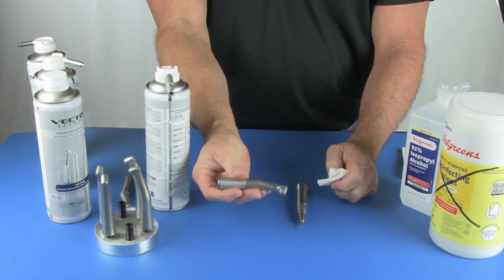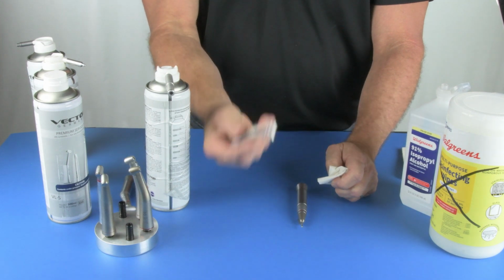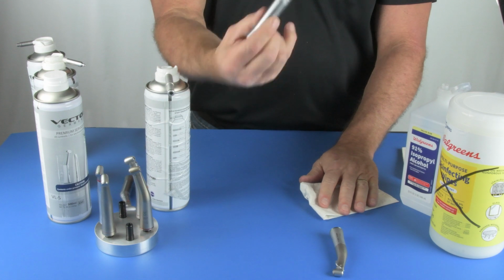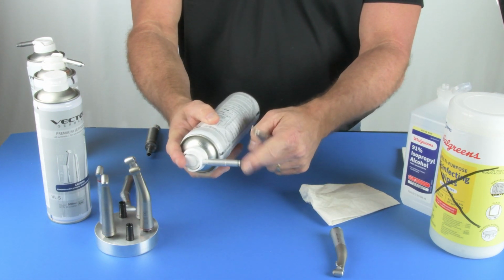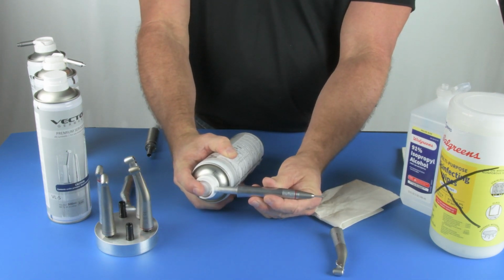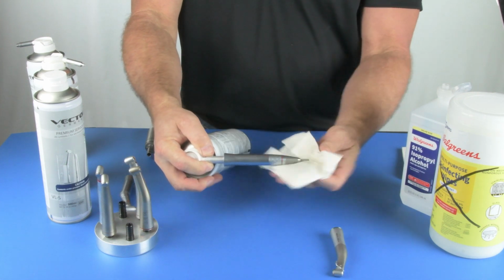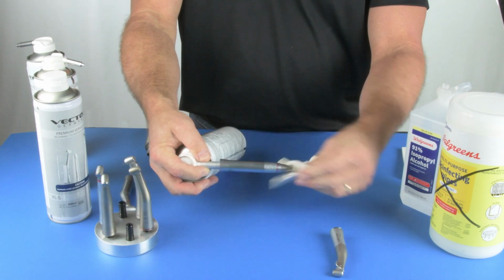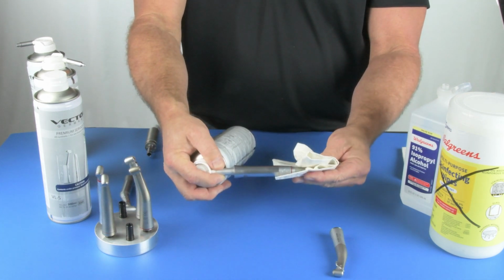Bag it or unbag it, whichever your office does, sterilize the handpiece, and when it comes out, it's ready to use. On the oral surgery style handpieces, the basic step is the same. You're going to use the correct attachment that slides up all the way in. You spray the handpiece for 2 seconds. Continue if it's not clear. If you see blood or any other dark material coming out into a white rag, if it's running out dark for any reason, continue until it's clear because that's probably blood.